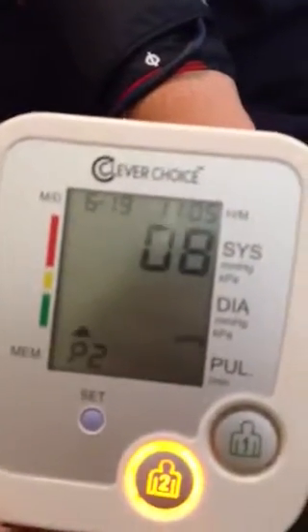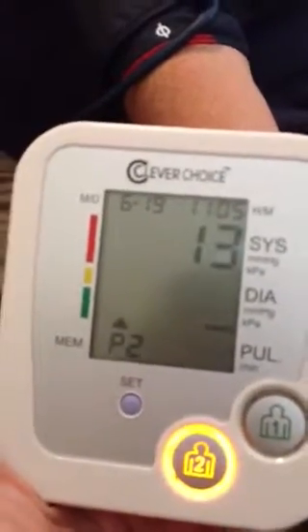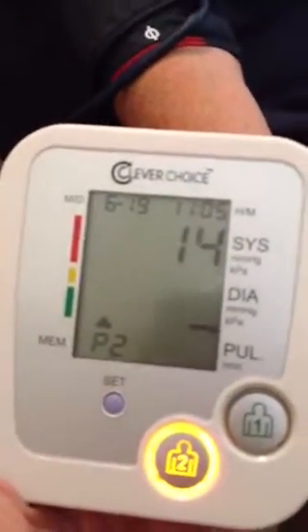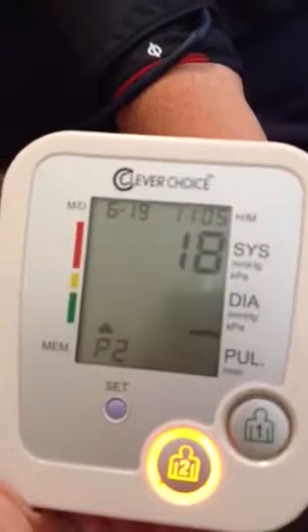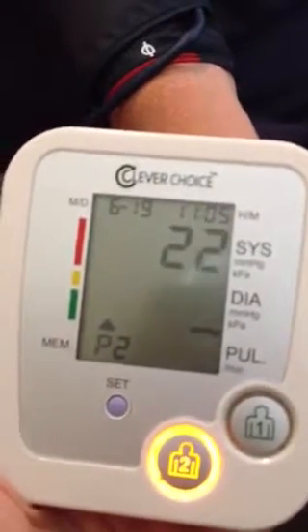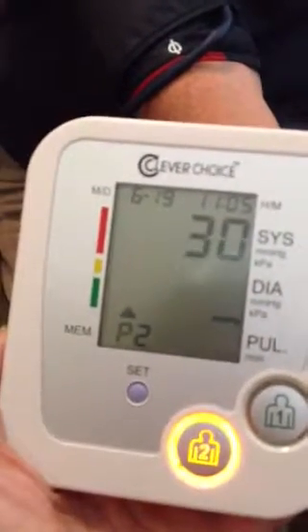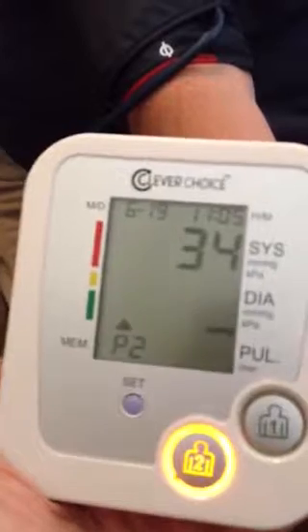After using it a few times I can say that it compares well with our more traditional blood pressure machine. It's also going to show the heart rate. Also, if it gets too tight just press that button and it quickly deflates.